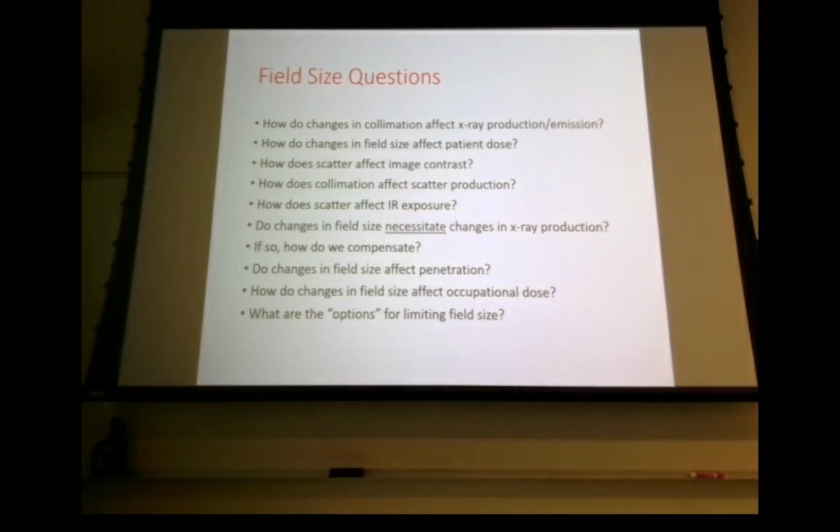Again, your computer algorithm is a main thing. I would hang on to the concept that it might affect your contrast all the way through the registry because you might see it, but in reality, if you collimate down in clinicals, you might not be able to see any kind of difference. So on test questions, would it increase contrast? Yes. Anytime you have fog, it decreases contrast. So if you can prevent it from being created or remove it after it's created before it hits an image receptor, then theoretically contrast improves. Very good. Okay, so how does it affect scatter production?